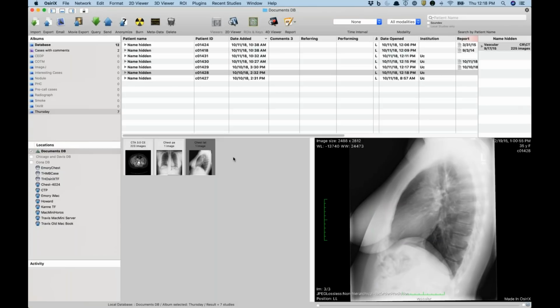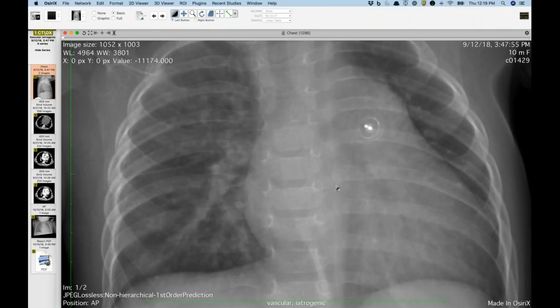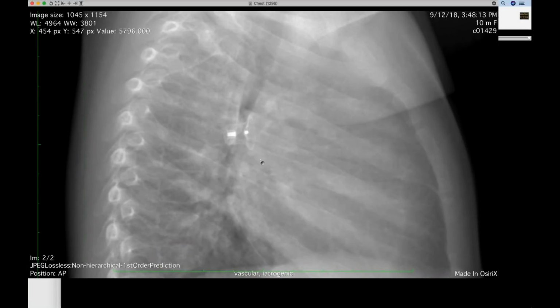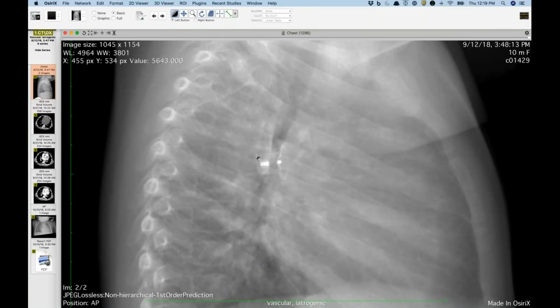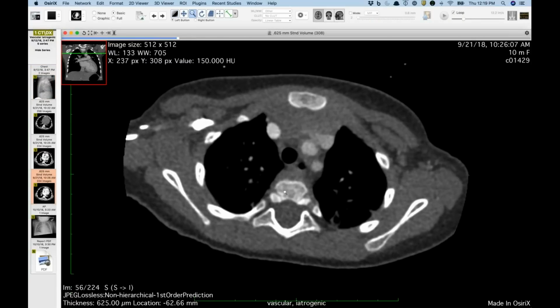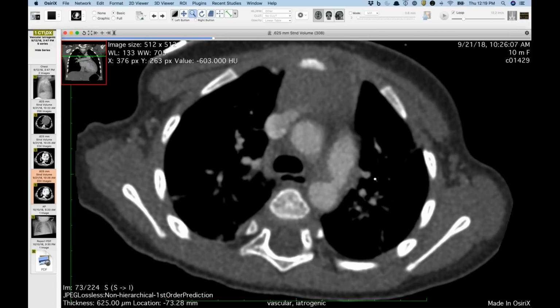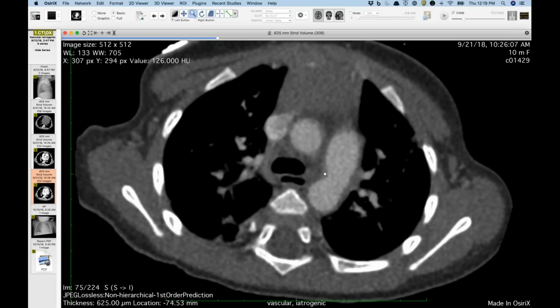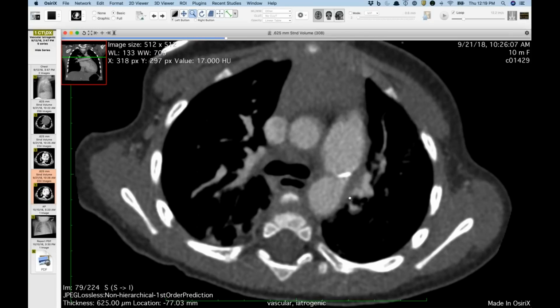And so if we go back to what we see in this case, this being abnormally oriented, they knew from echo there was still a large residual shunt after they placed this, and they thought that this device had migrated. And what you'll see on the CT that was done here is the aorta, here's the patent ductus, and there is no closure device in it.